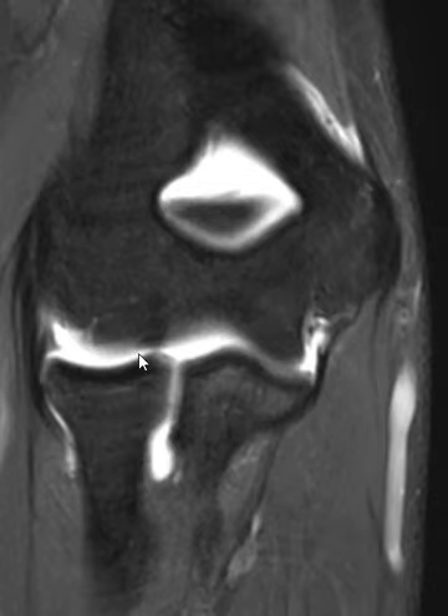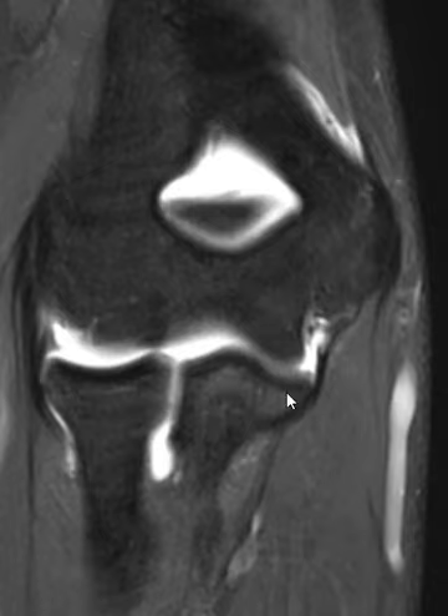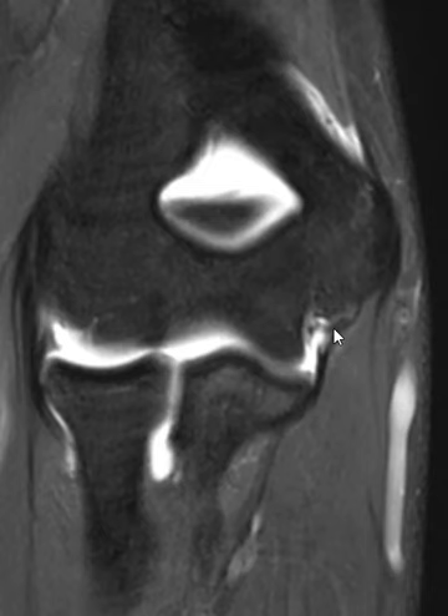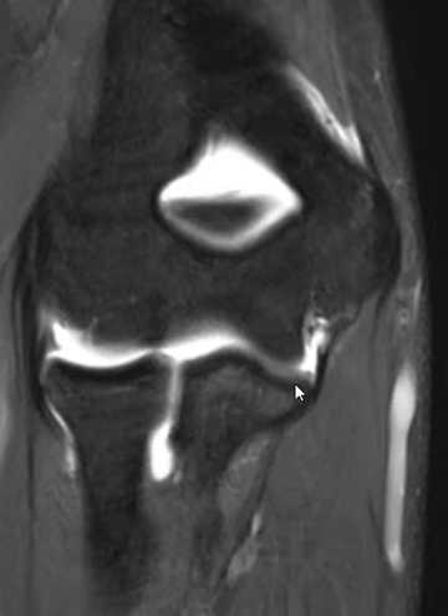We did an arthrogram — you can see fluid in the joint here. Here's the radial head, and this is the ulna. The medial margin of the ulna is the sublime tubercle; that's where the UCL attaches. You can see this vertical band coming down — this is the ulnar collateral ligament — and it attaches right here on the bone.